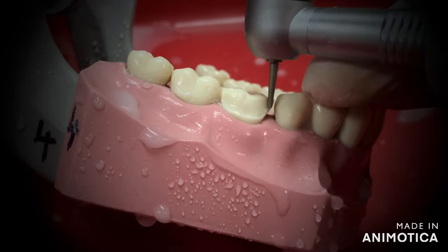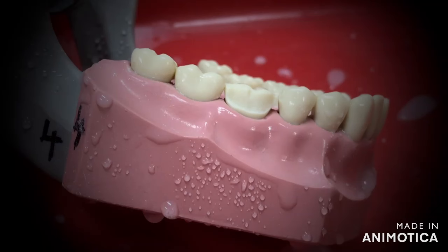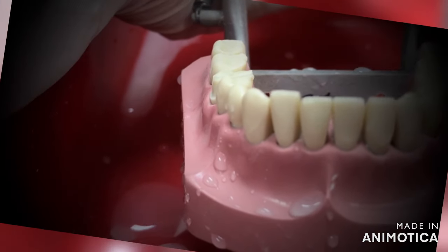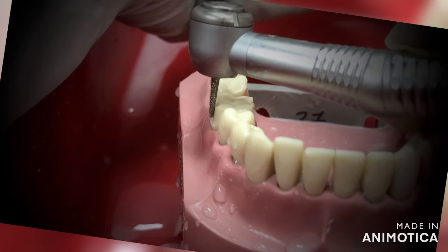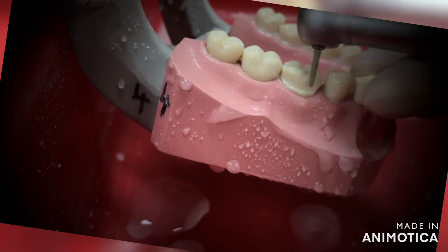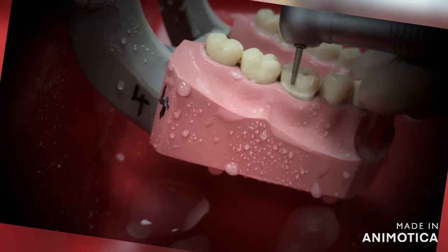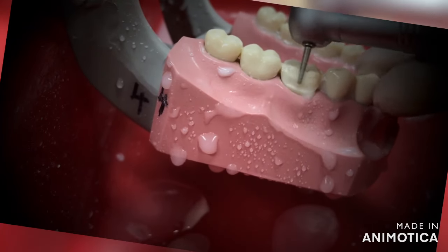After you are done with the cervical part on the buccal surface, you can then go to the middle third of the tooth surface. Slightly tilt your burr and run it across the surface from mesial to distal. This is your two-plane reduction. It gives you an adequate amount of reduction for your crown. We are trying to maintain the original tooth contour here and minimizing any error for over-reduction by doing this. You can appreciate the two-plane reduction in this image.